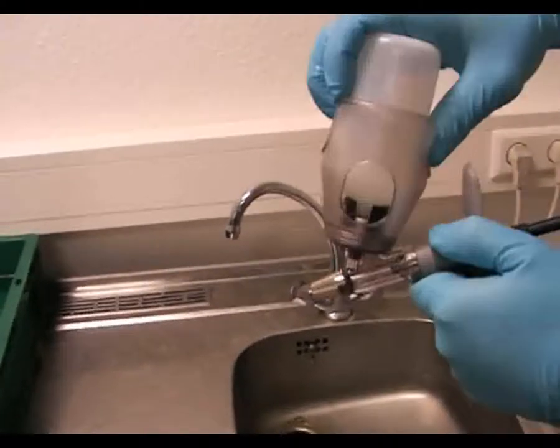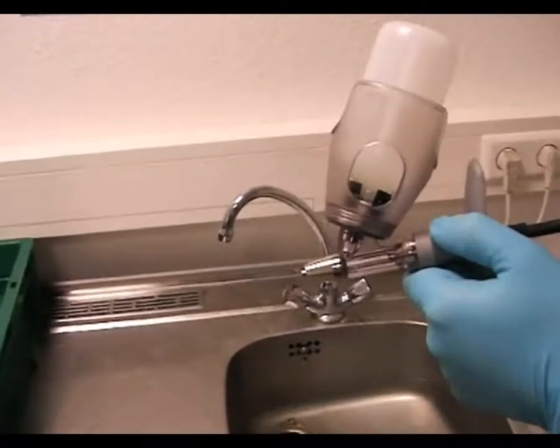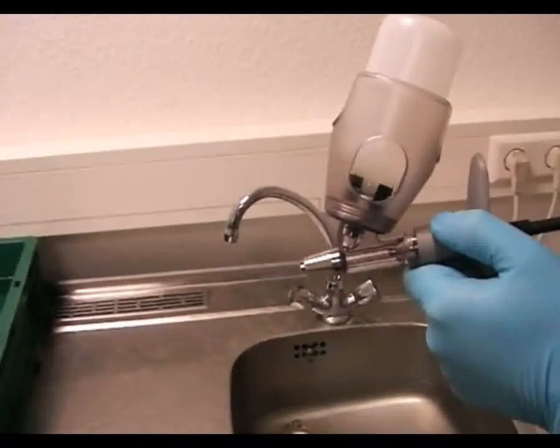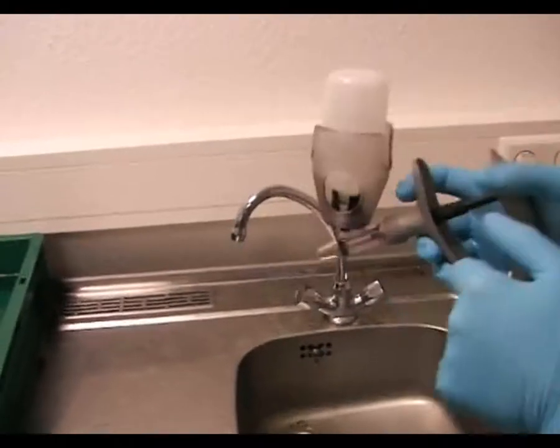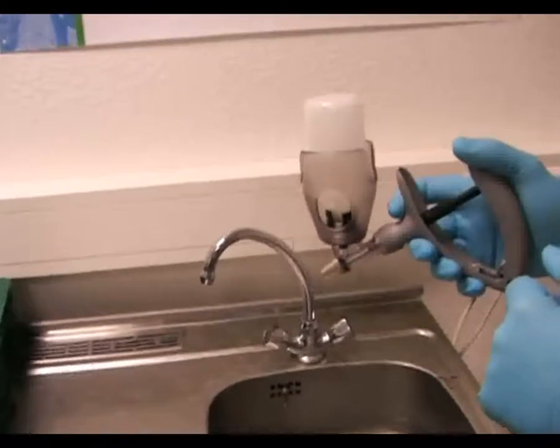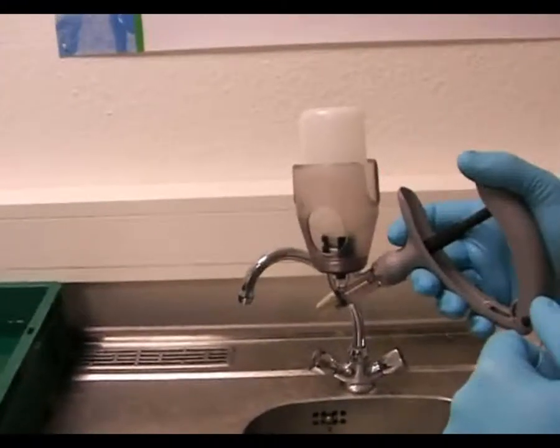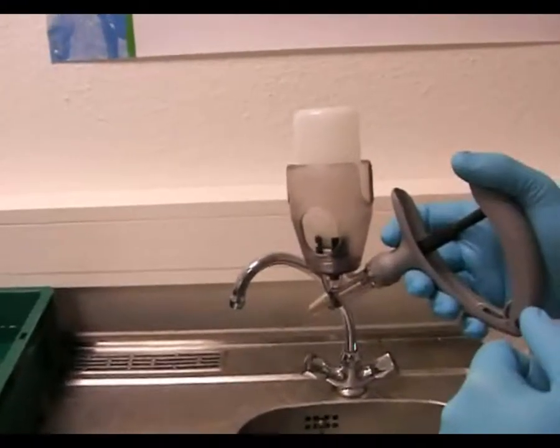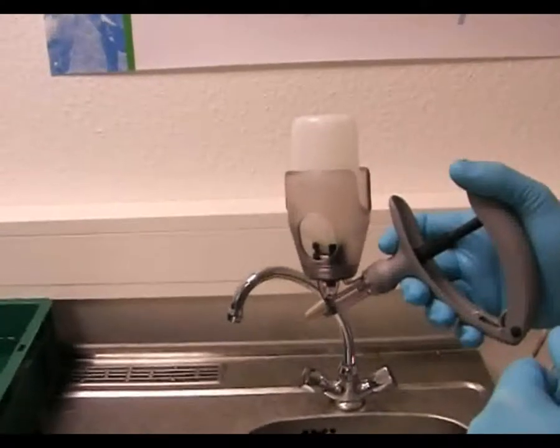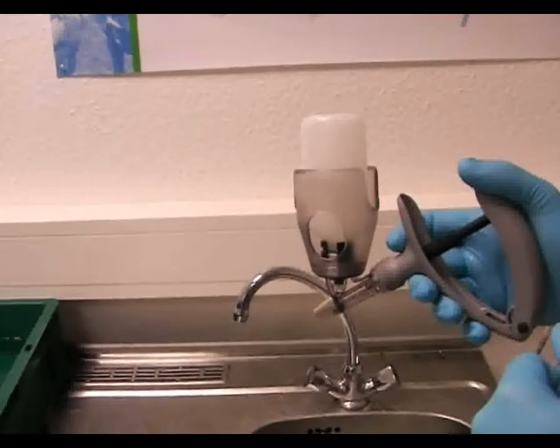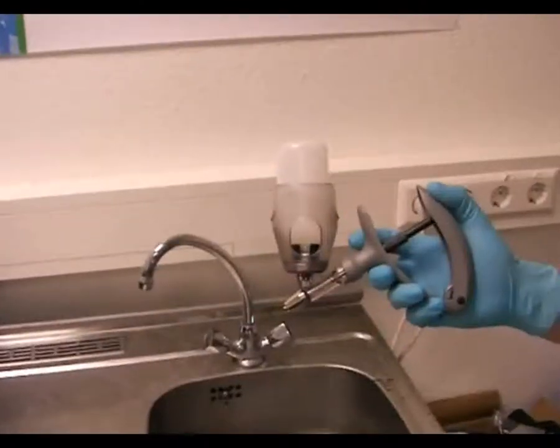Nun wird die Spritze durch ein zweimaliges, schnelles Bewegen des Griffes mit dem Medikament, hier natürlich trocken vorgeführt, aufgezogen. Nach dem zweiten Kolbenhub ist die Spritze aufgezogen, ohne Luft und nach Ansetzen der Kanüle kann die Injektion beginnen.